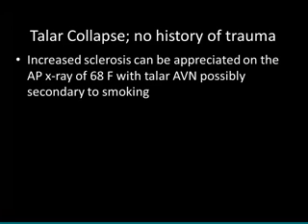Okay, let's look at a talar collapse, no history of trauma. I think this has happened to all people that do total ankles and can happen to any particular prosthesis.